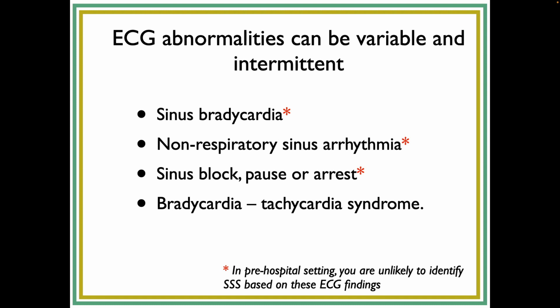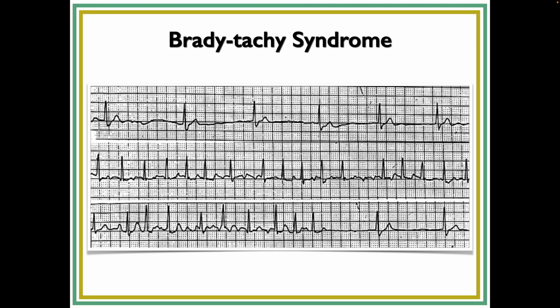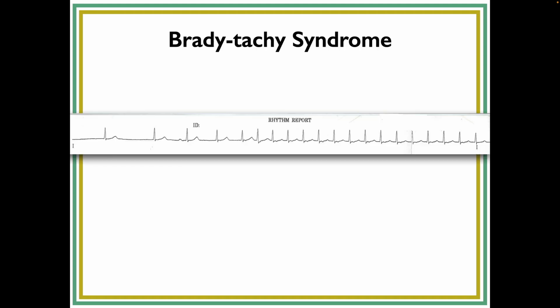Brilliant, good. Okay, the one reason I'm mentioning sick sinus syndrome is because, although it's pretty rare, you might see alternating bradycardia with tachycardia. Let's just look at it. If you see something like this, where it's slow, it's fast, it's slow, it's fast, that could be sick sinus syndrome. And in this particular case, just get them to the hospital. It doesn't make sense to treat the bradycardia. It doesn't make sense to treat the tachycardia. So here's another example. Brady-tachy syndrome is a version of sick sinus syndrome.